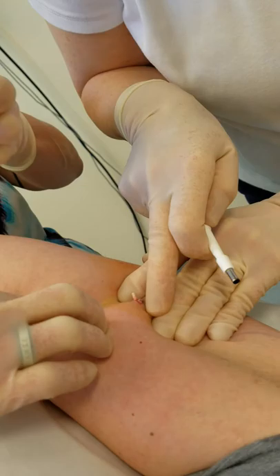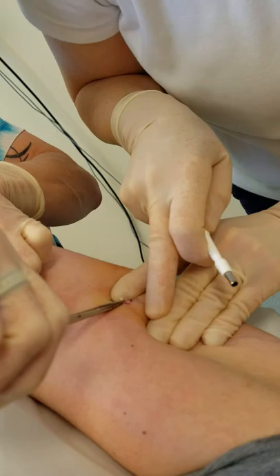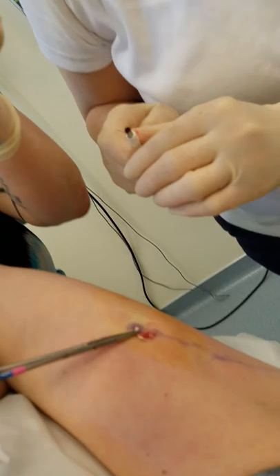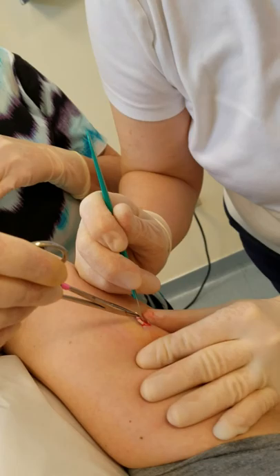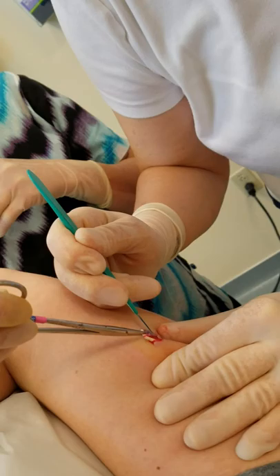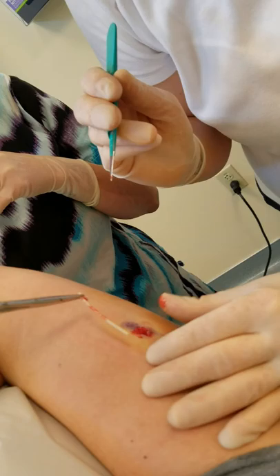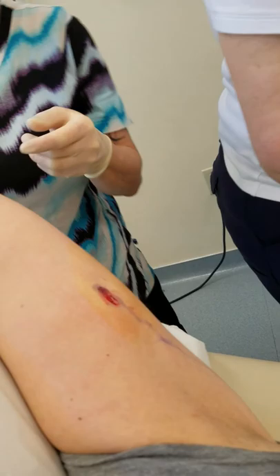I'm going to have my assistant palpate the proximal end across the end of that. Now often we have to do a little bit of dissection. Unfortunately we didn't have the scalpel right ready, so my assistant is just putting a little bit of traction on there. We just dissect a little bit where the Nexplanon wanted to adhere to the tissue in here. It just pulls out nicely.